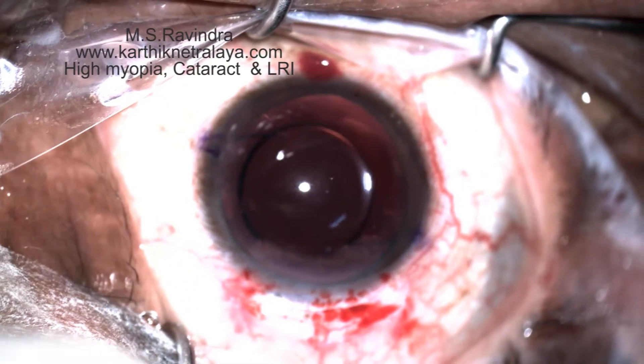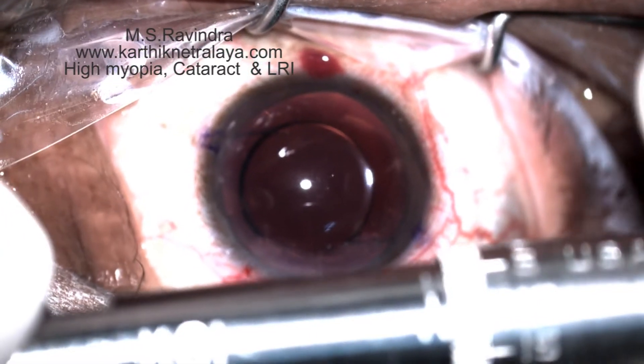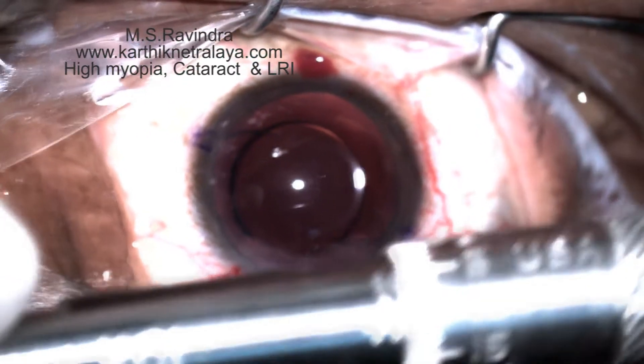After the cataract surgery, when the eye is firm, an arcuate knife is used to create an LRI in the inferior quadrant, centered at 110 degrees, which is the steep axis on the cornea.